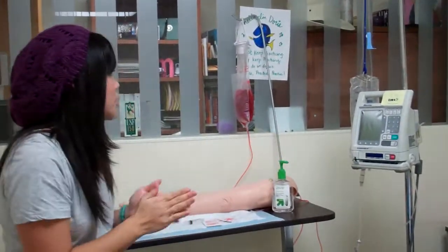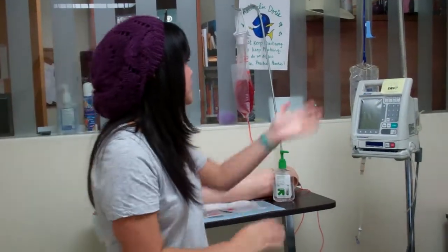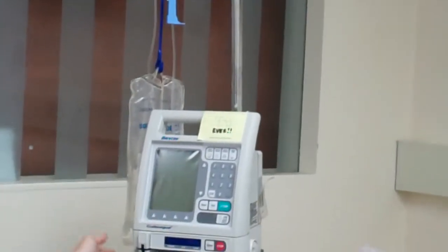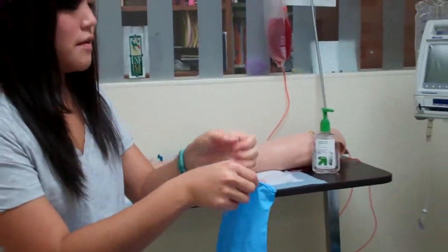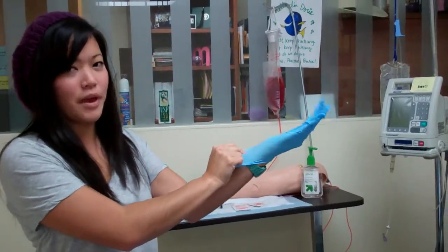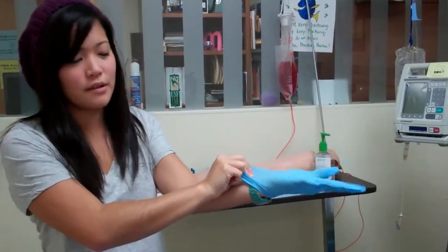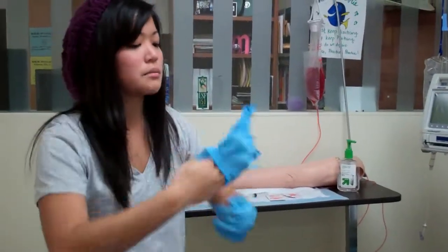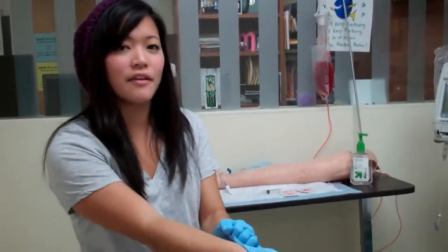So I would already have my primary bag set up, running with normal saline. For this purpose, it's just disconnected because I'm going to check the patency of my IV line. While I'm doing that, I'm also assessing the IV site.